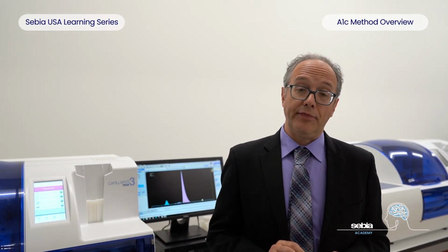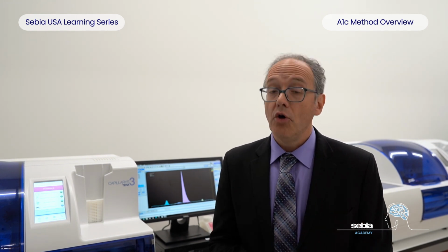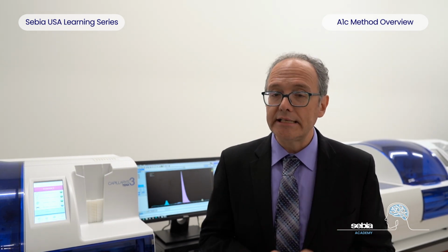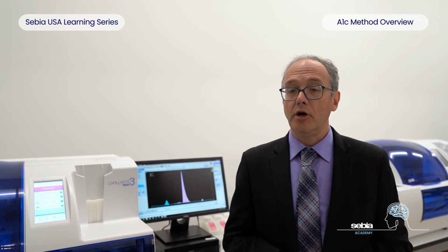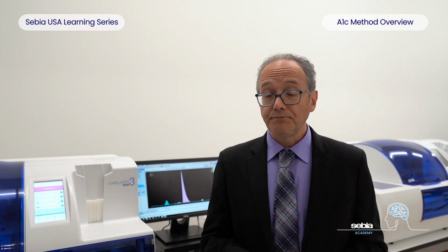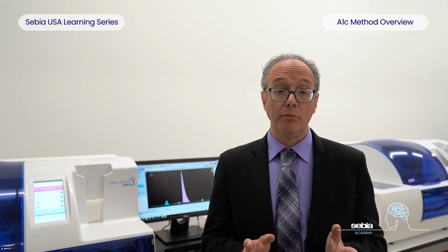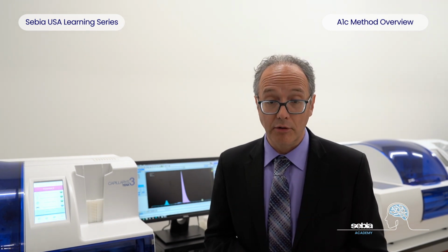Similarly, a newer method for measuring hemoglobin A1c is the enzymatic assays, which use enzymes that recognize and digest a targeted section of the hemoglobin A1c molecule. However, both of these methods are unable to differentiate between normal and most variant hemoglobins.